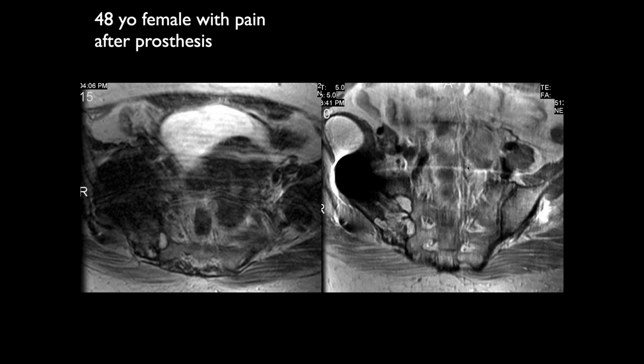Ashley, what do you think about this case? 48-year-old female with pain after prosthesis. We're looking at the right hip. There's a lot of fluid collections around the prosthetic device, both along the lateral and medial margin. It looks like almost some irregular ossification there as well.